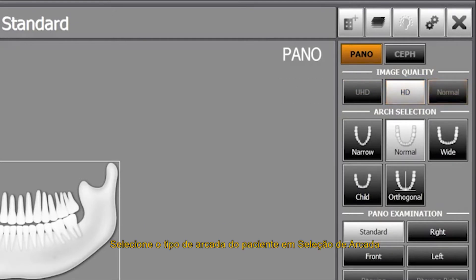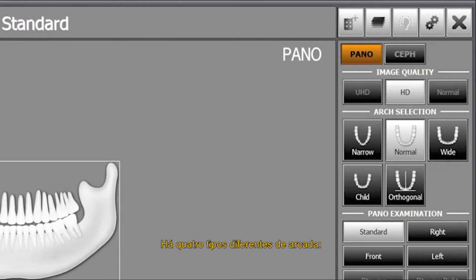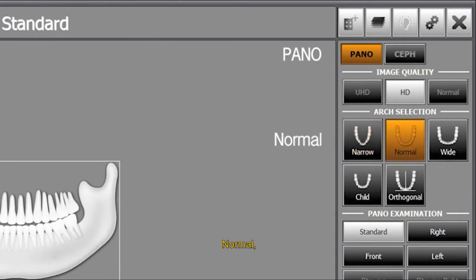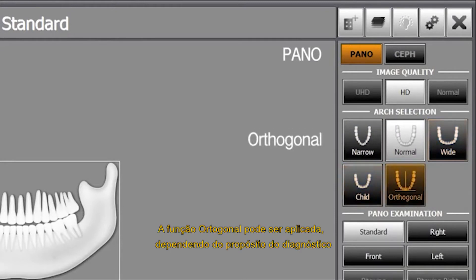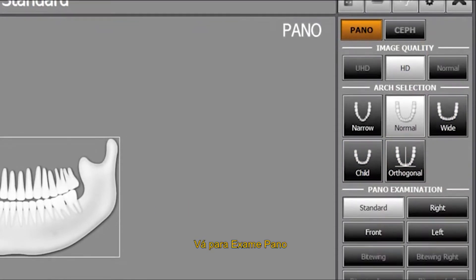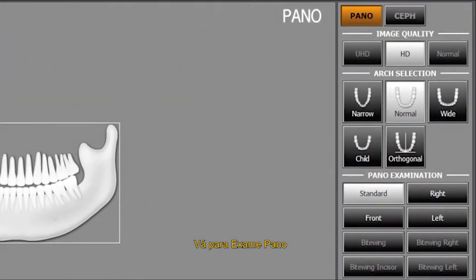Select the patient's arch type on the arch selection. There are four different arch types: narrow, normal, wide and child. Orthogonal function can be applied depending on diagnostic purposes. Go to pano examination and select ROI.